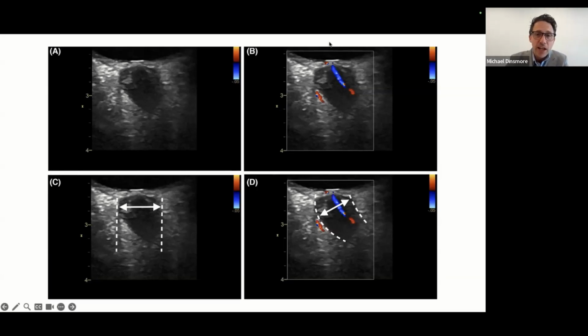If you look at B and you actually trace the retinal artery and vein, you can see how it starts to curve down the center of the line. So it's actually curving off the page. And if you were to draw the lines of the actual sheath curving like that, you'd have a more realistic view of what the optic nerve sheath is.